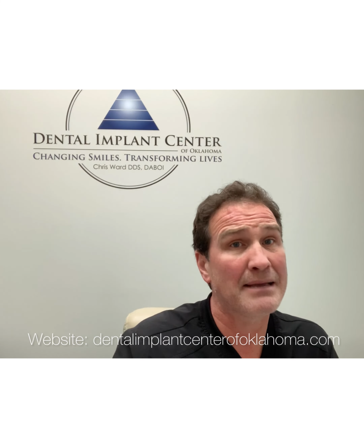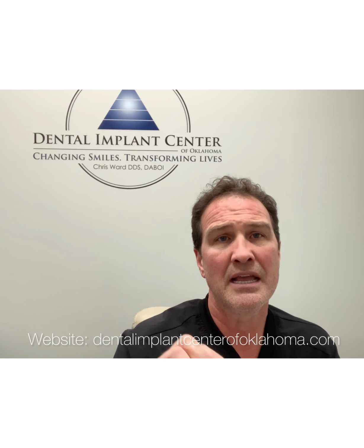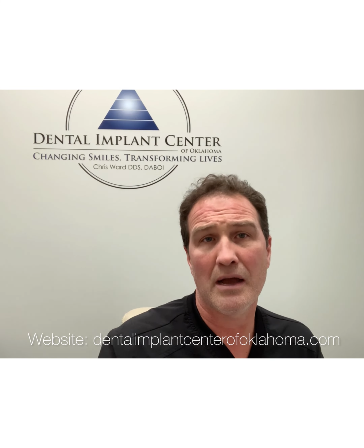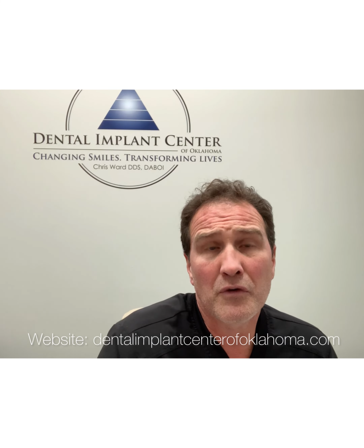Anymore with CAD/CAM and some things with the CT machines that we have and stereolithic models, we can actually fabricate those just from the radiographs and x-rays that have been taken. So that's a little bit less invasive, but those are not done that often, but they are options for people. So there's lots of different types of dental implants. I hope this is helpful for you.